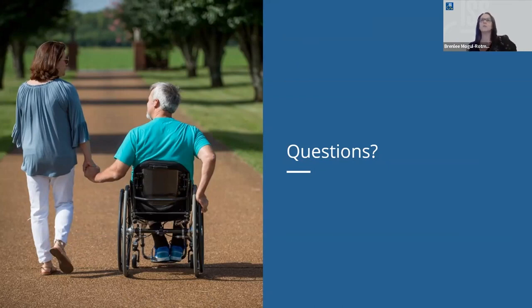I think it's important from our perspective as clinicians to give them the, if we do this, then these might be the implications if we do it this way. So if we have a taller back, it might get in the way a little bit of you propelling. However, if we go with a lower back, you might be able to propel better, but you might feel less stable. So maybe there's a training component there. Maybe there's looking at something that has some adjustability in the mounting that we could move it up or down a little bit without losing that PSIS. So all of those things I would think should be considered. So Eleni, I don't know if you have something else that you would consider for that one.